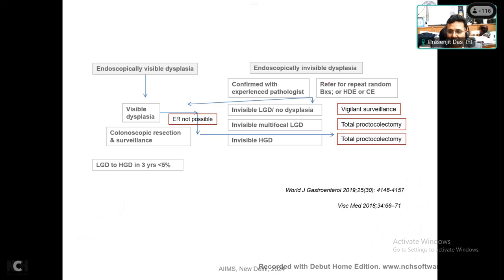What can complicate the course of IBD? A superadded inflammation like CMV. If there is a CMV infection, the patient can present with acute severe ulcerative colitis. I did not touch all those features because the time was short. That is also called necrotizing colitis, and it can be a complication. So always comment on whether CMV inclusions are there or not. The second most important thing, as it is a complication of chronic follow-up, is whether dysplasia is there or not. You have to comment.